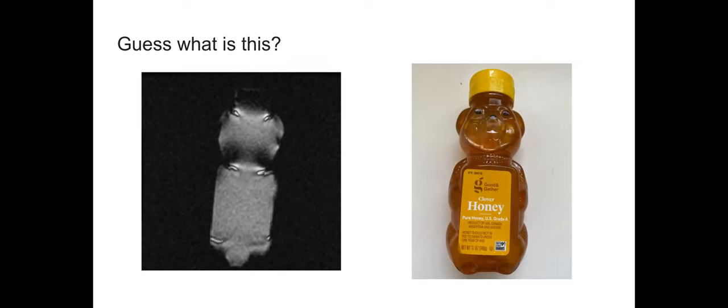All right. So you can see the susceptibility artifacts exactly where the bottle kind of curves, which creates a big susceptibility problem. Right. That's why shoulders are a problem. That's a great image, by the way. Can I use it for next classes? Sure, I'll send them to you.